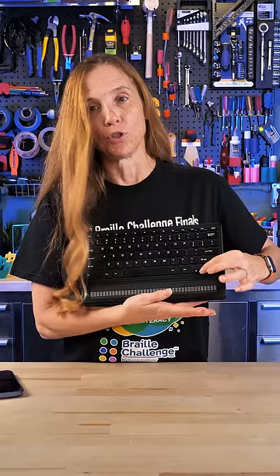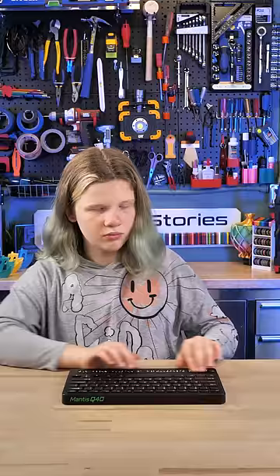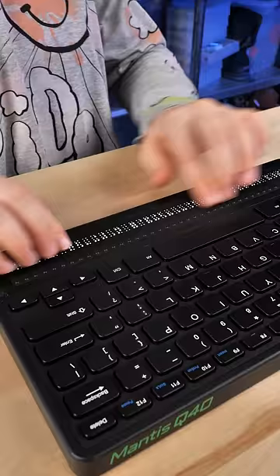She can go to web pages with this. She works on her Google Docs with this. She's even reading Percy Jackson and the Lightning Thief, 40 characters at a time.